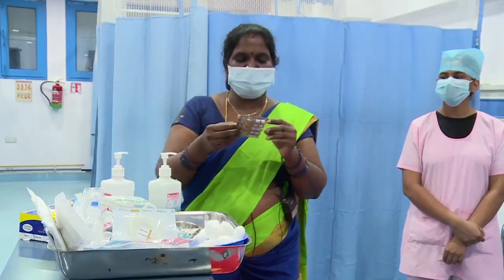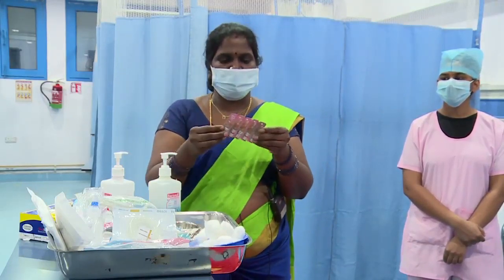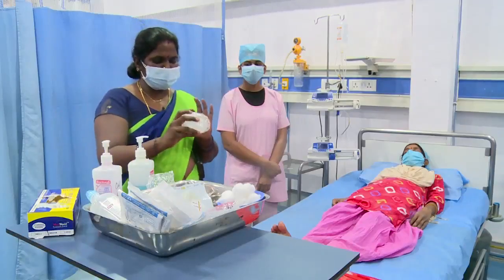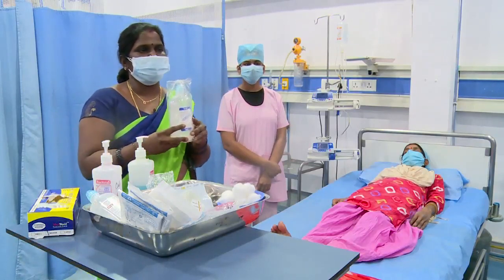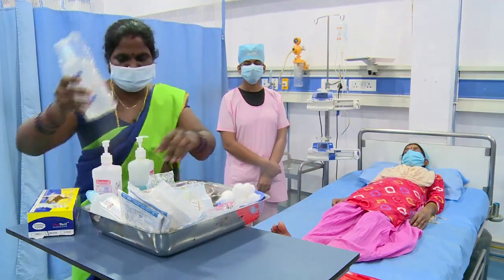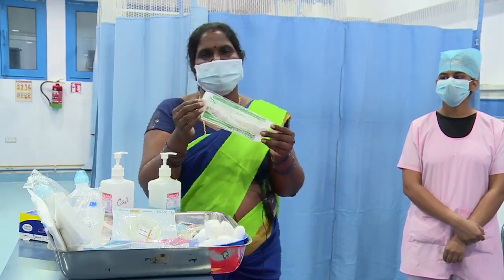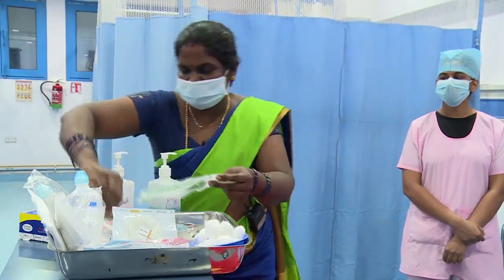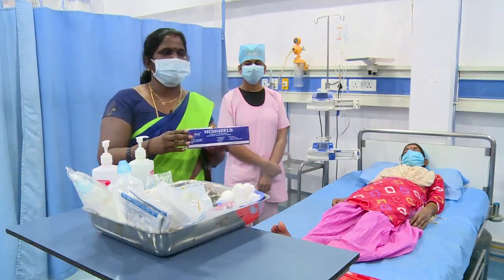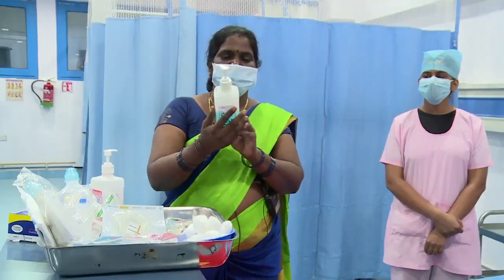And this is sterile noradrenaline injection, where one ampoule contains 5 ml, and this we can also use for inotropic drug purposes. And this is 10% dextrose. This fluid we can also use for IV bolus maintenance, along with the inotropic drugs. This is the IV set we can use to connect the IV bolus bottle to the patient's IV connection. And we use disposable gloves for every touch of the patient in the patient care unit. And this is methyl spirit.